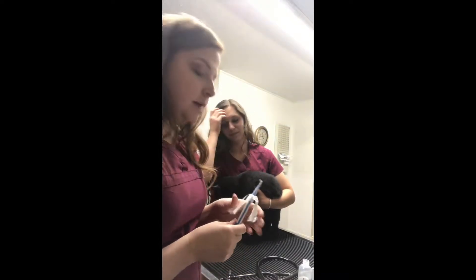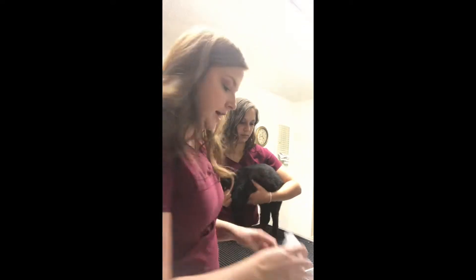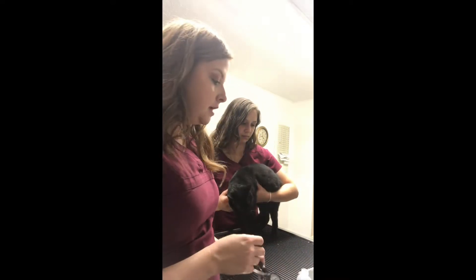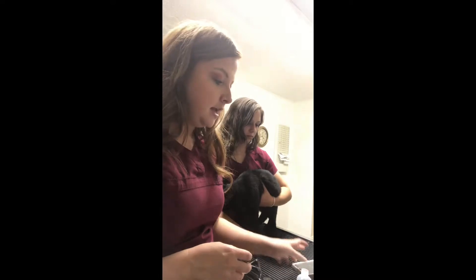We have moved over to our wet table and I have my friend Julissa here helping. We have a few different things: our thermometer because we're gonna take the temp in a minute, some lube for that, a stethoscope, and I'm going to use Julissa's phone as a stopwatch for counting heart rate and calculating respiratory rate.